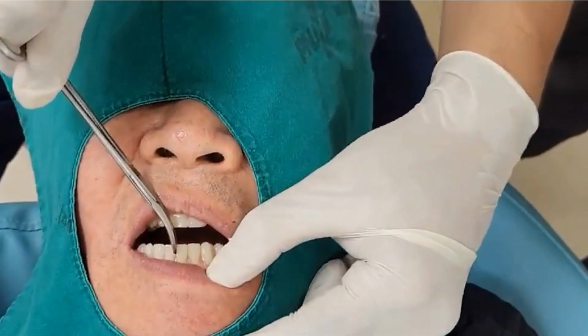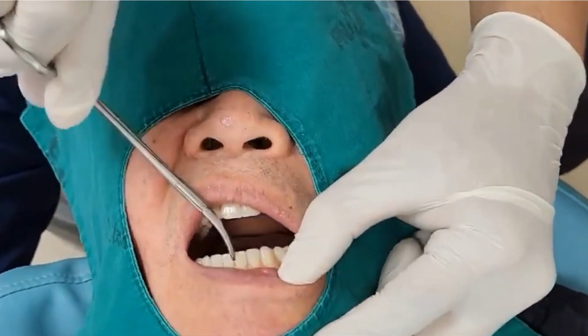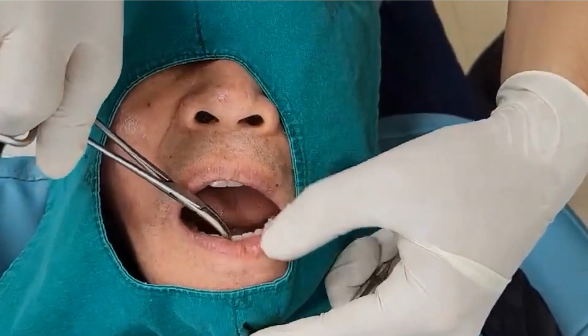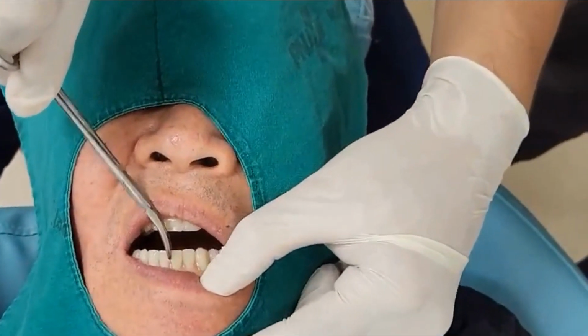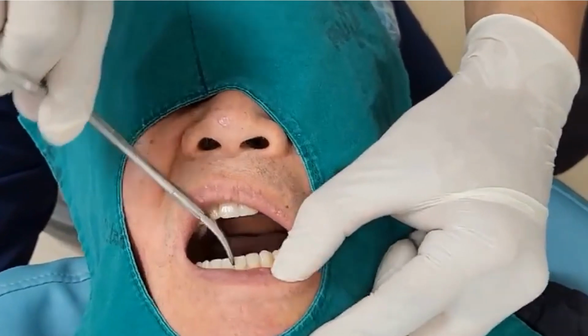While not every case will achieve this exact result, by taking a closed mouth impression and using the JB tray, we can create an extended, well-fitted tray that enables stable recording of the vertical dimension and centric relation. This ultimately leads to a secure and stable denture.